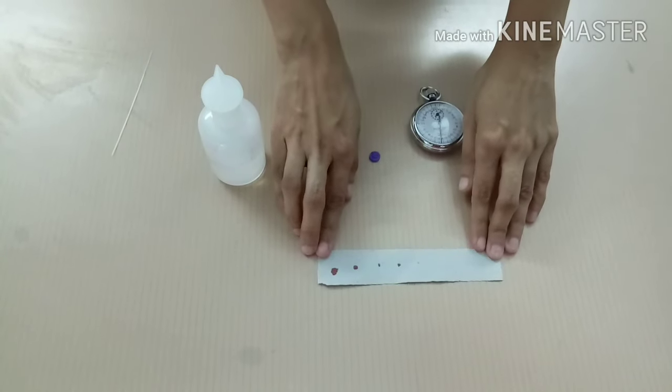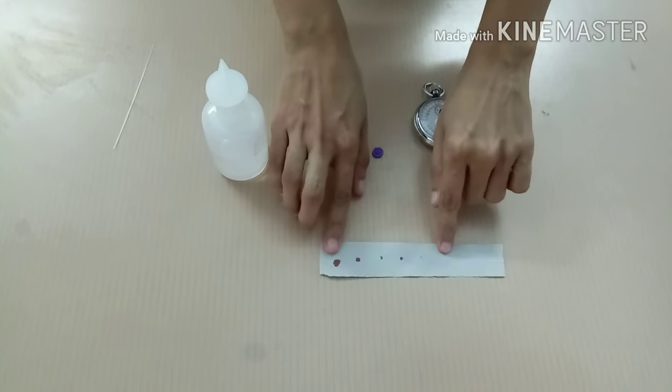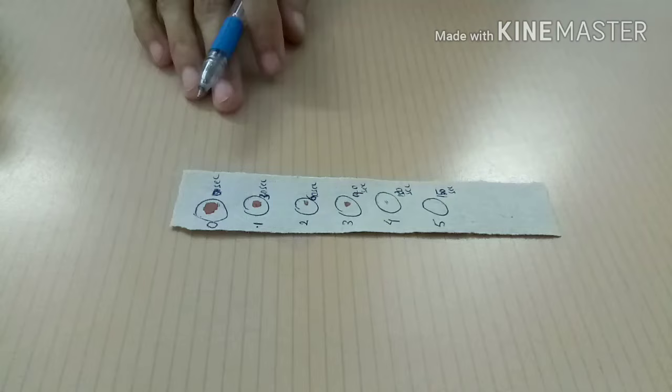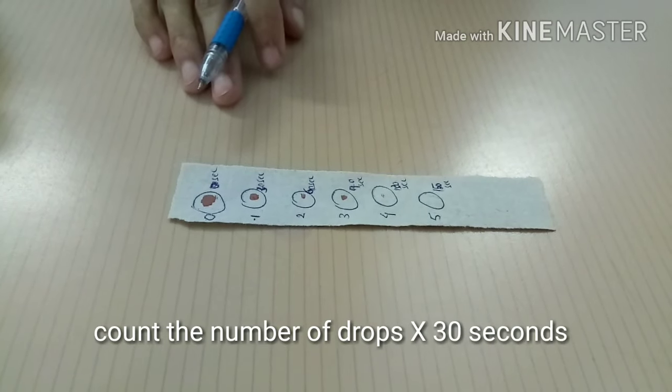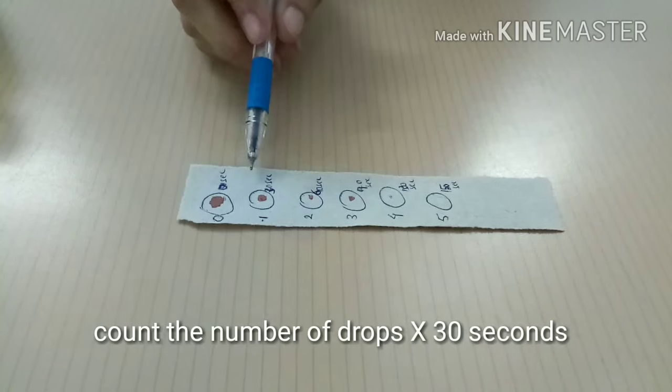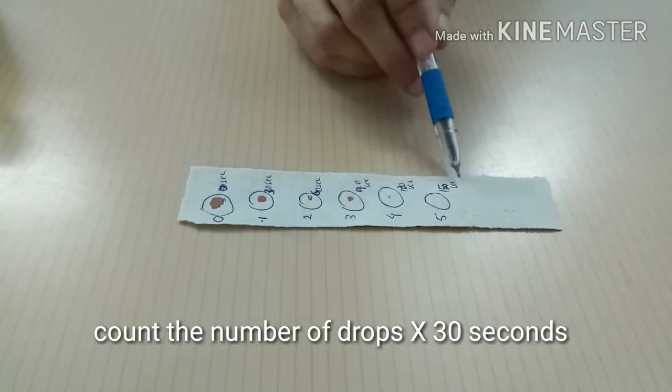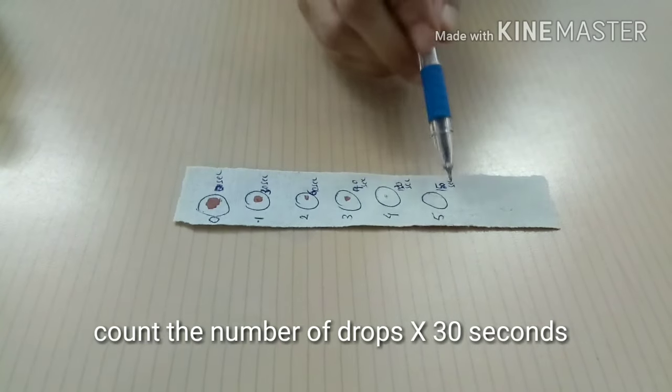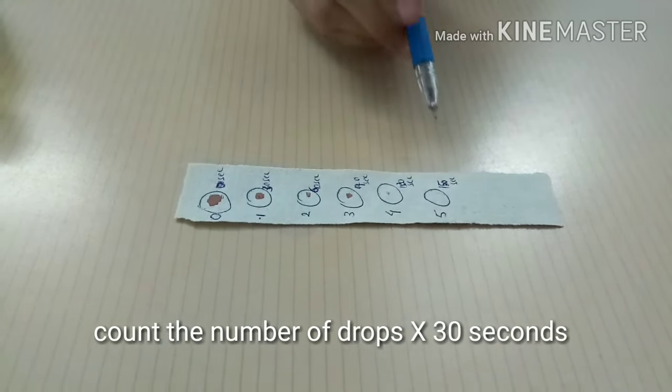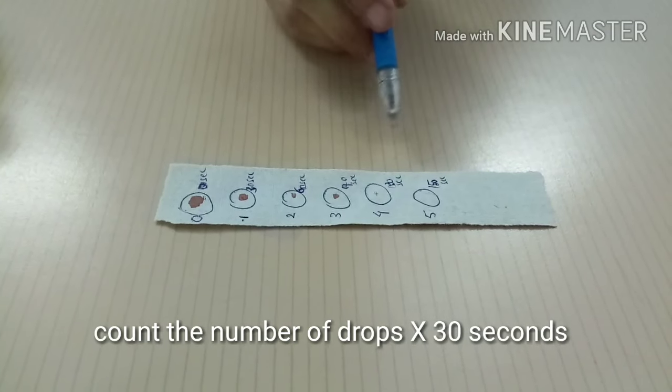Duration of time is from the first drop till no blood stain on the filter paper. Conclusion. Count the drops starting from drop taken at 0 second to no blood drop. You can see here we have counted from 0 to 5: 0, 1, 2, 3, 4, 5 multiplied by 30. So the bleeding time is 30 multiplied by 5 equals 150 seconds.